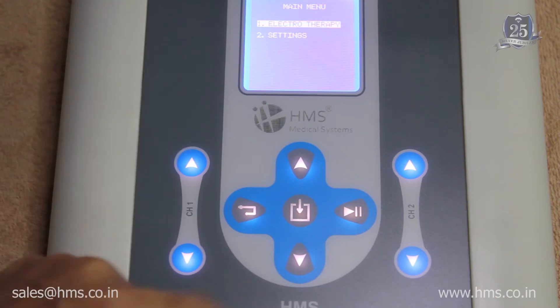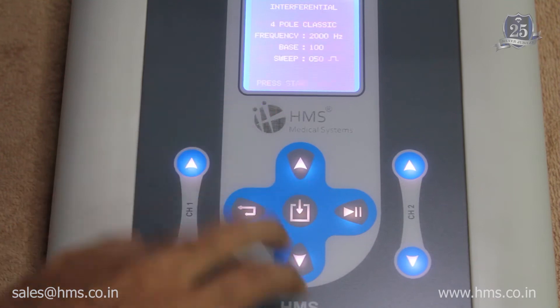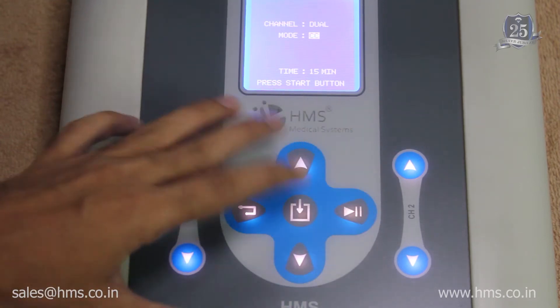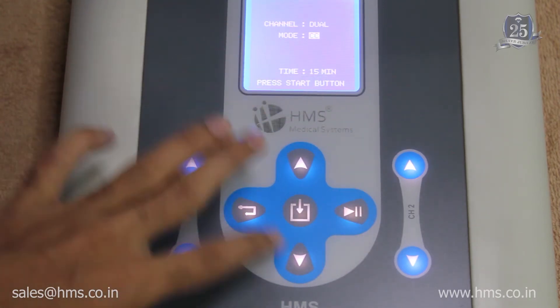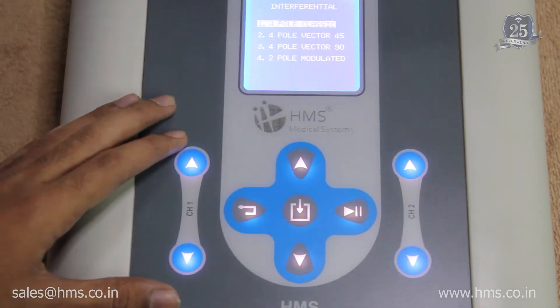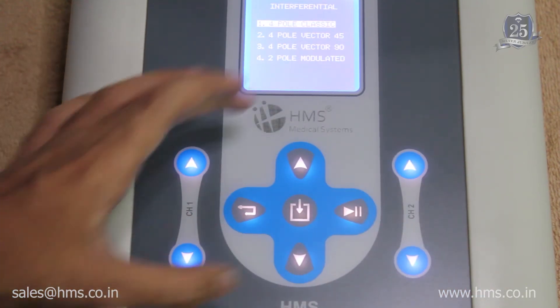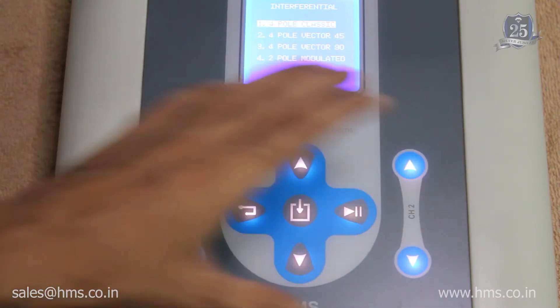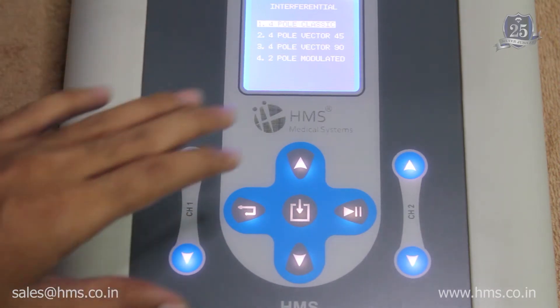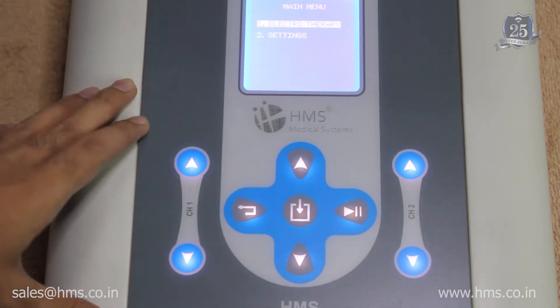As you can see, it comes back to the main menu. After selecting your desired program with the select button, this button is used to start the treatment — this is the start/stop button. These two pairs of buttons to the left and right are the intensity controllers for channel 1 and channel 2 respectively. We've designed it in a very minimalistic way so that no one gets confused while operating the machine.